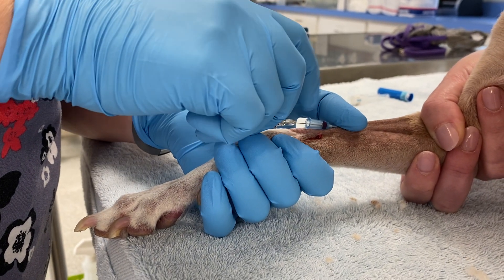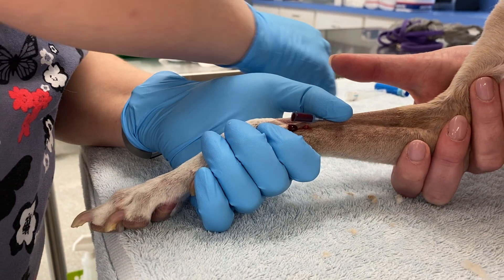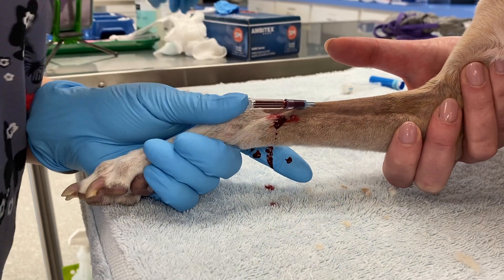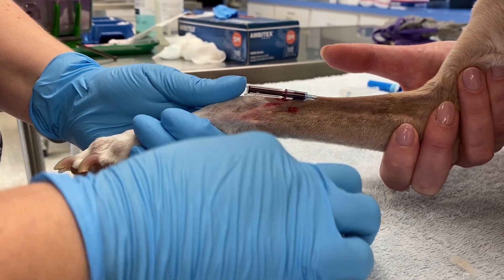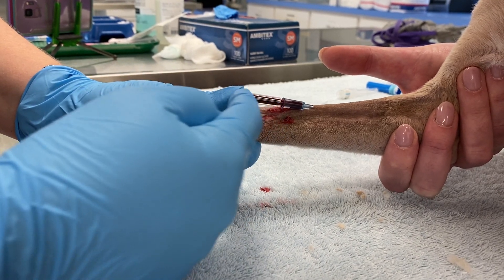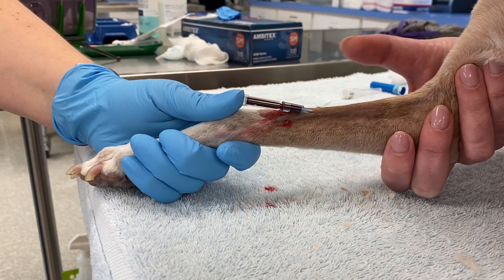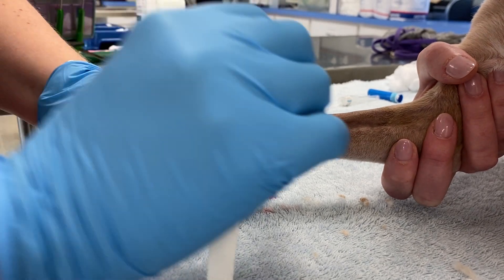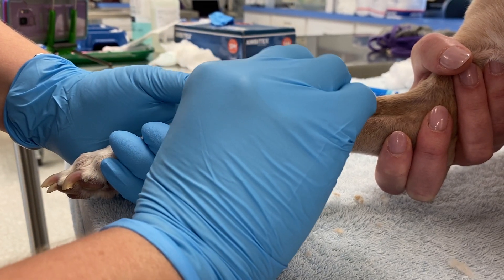If you take your thumb, you can go to the top — sometimes it likes to slide forward. Use your temporary cap and slide that on. A little blood's not going to hurt anything; in fact, it lets you know that your catheter's still in. You can see how I've got my thumb on the end of the temporary cap — do not put it on the end of your catheter. If you put your finger on the end of the catheter, you're going to cause it to become contaminated.